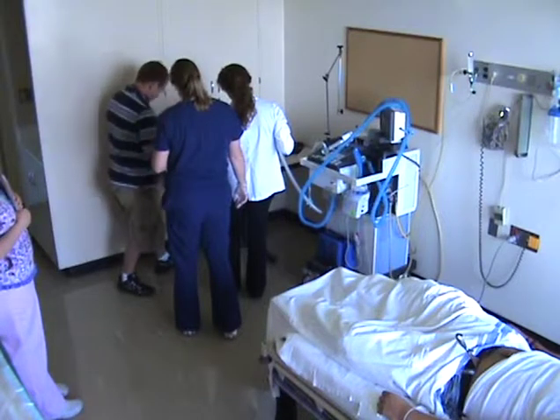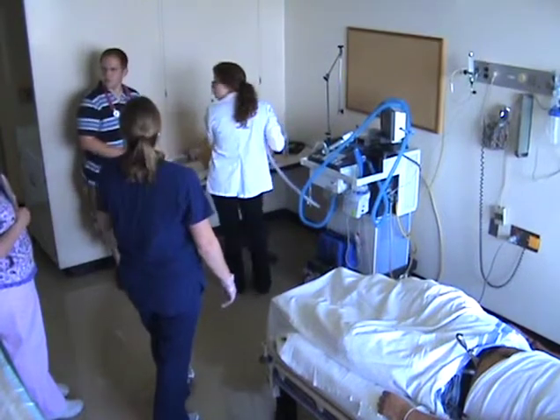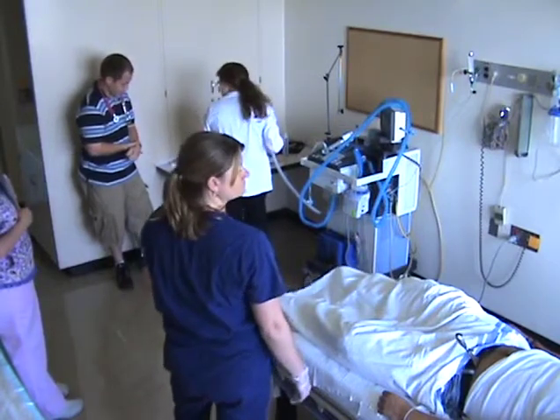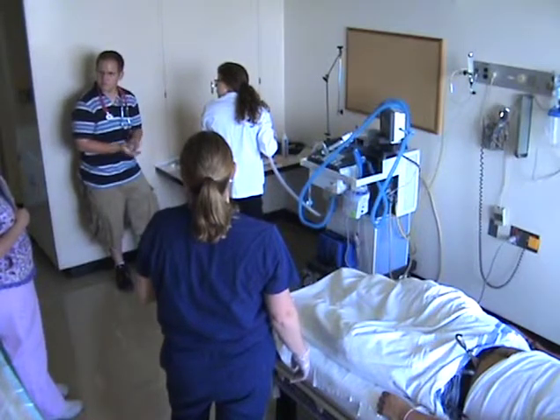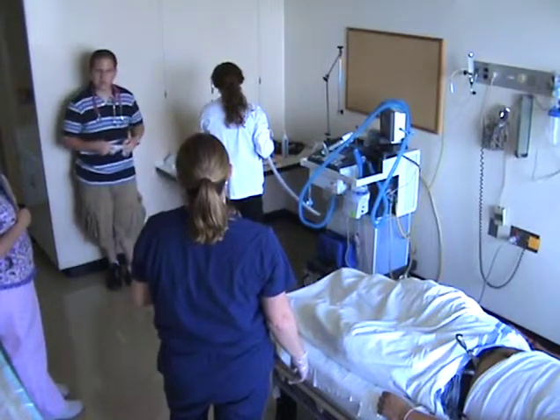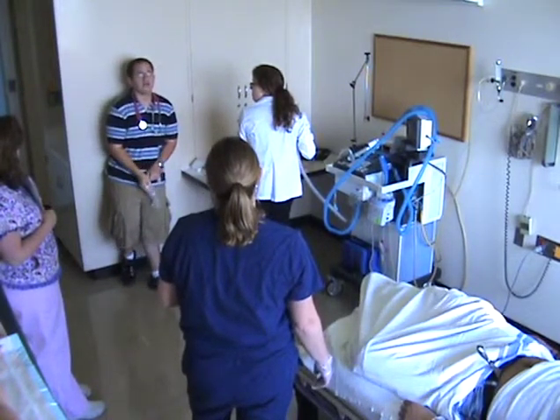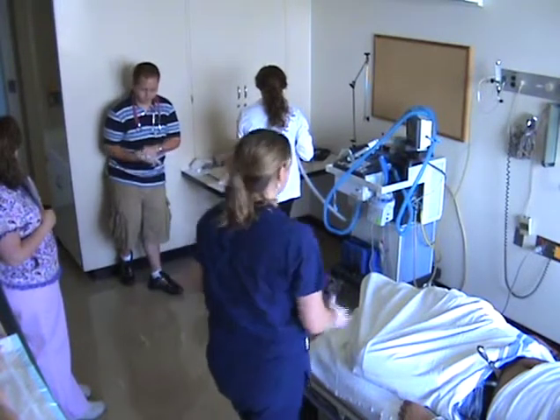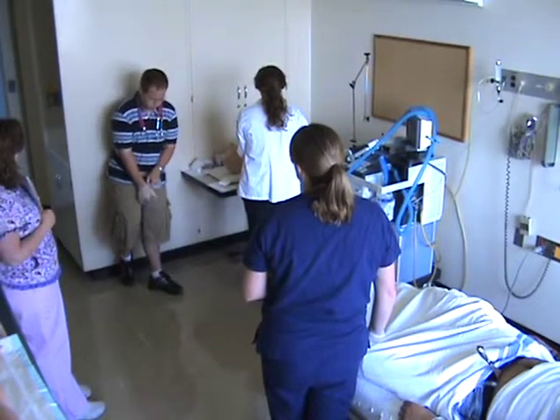Okay. So if you want to go ahead and set the vent settings and get him on the ventilator. And what is the height of our patient? Oh, 6'2". Okay, for 6'2", I'll probably say about 700 tidal volume. Okay, that's pretty appropriate for now. And how do you determine that based on just height? It's actually 106 plus 6 times, in this case, 12 times 6. So there's a formula for it? Yeah, there's a formula for it. 6 times 12 is 72.